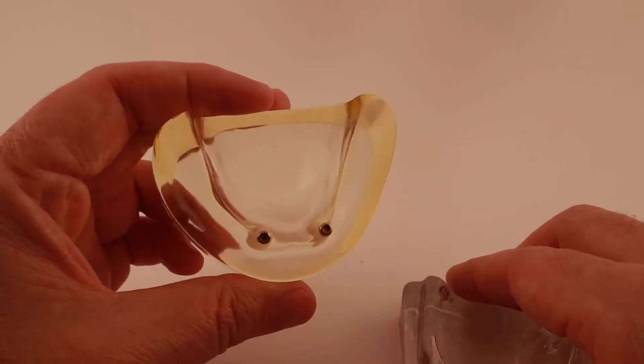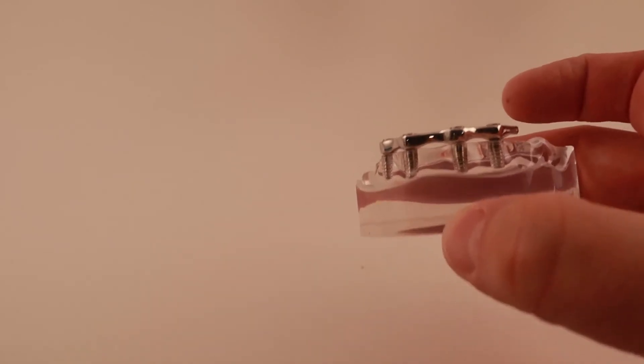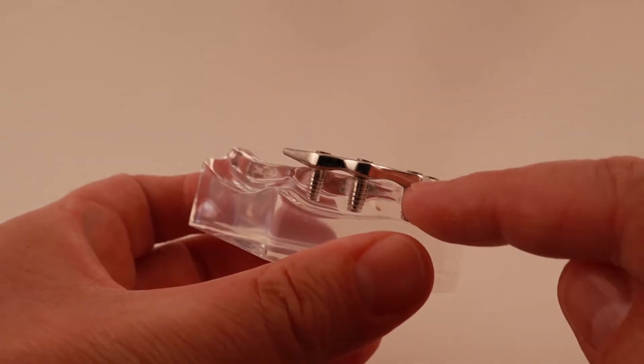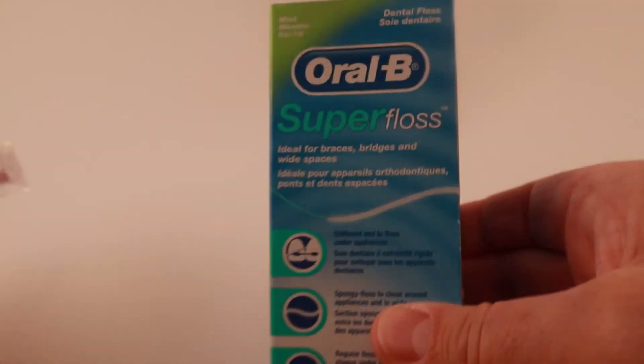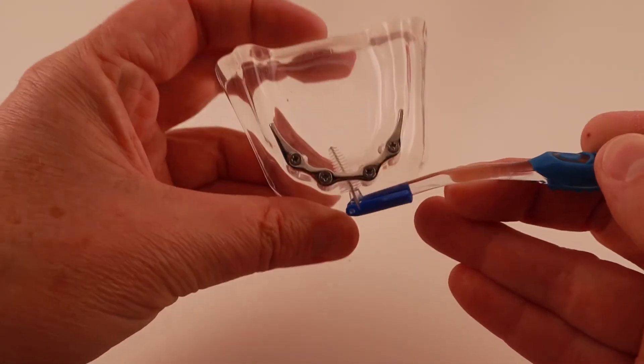Since the implant supported overdenture is held up by the implants and not by your gums, you can bite with more force than you can with an implant retained overdenture. Also, it will not move around at all. And because it's supported by a metal bar, the denture part can be made much smaller — it only needs to be big enough to cover the bar and seal it to the gums so food doesn't get under it. The downside is you need enough implants to support the bar, usually at least four, and some people need to have their jaw bones shaved down to make room for the metal bar under the overdenture.